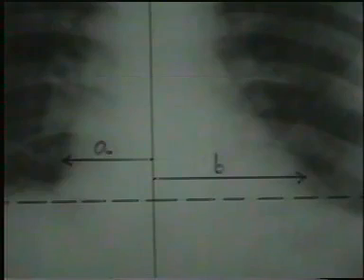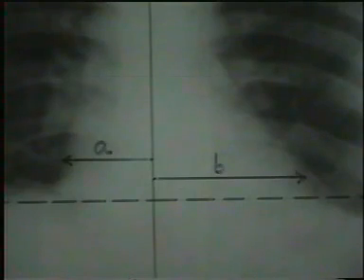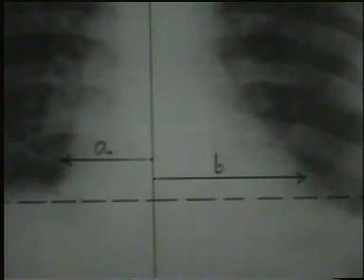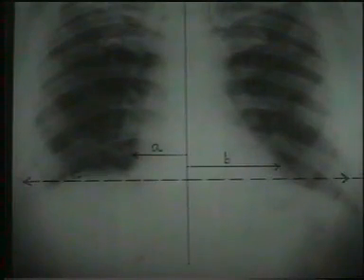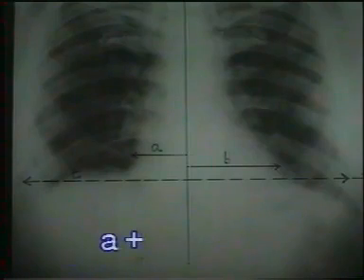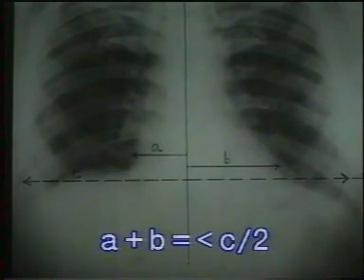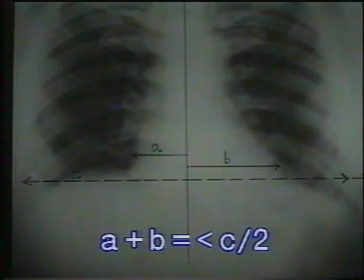To measure the cardiothoracic ratio, draw a vertical line through the center of the spine. Draw lines A and B perpendicular from this line to the maximum widths of the right and left heart borders. A plus B gives the maximum transverse diameter of the heart. It should be less than half of the maximum transverse diameter of the chest, that is C, the transverse line joining the inner borders of the ribs at the widest portion of the chest. We will study the details of the heart shadow in a later section.